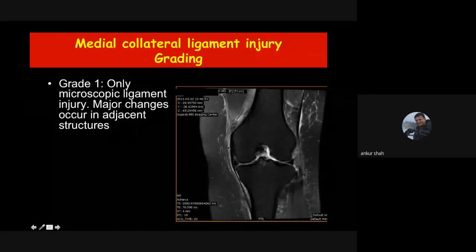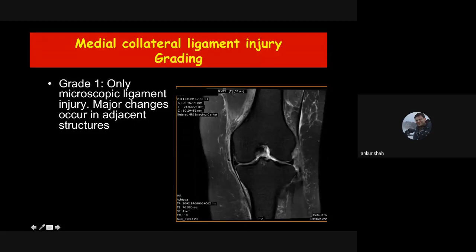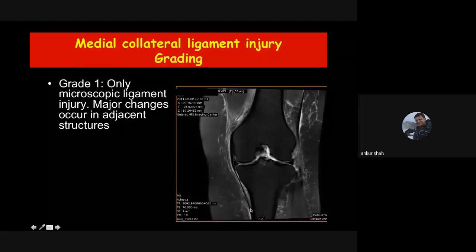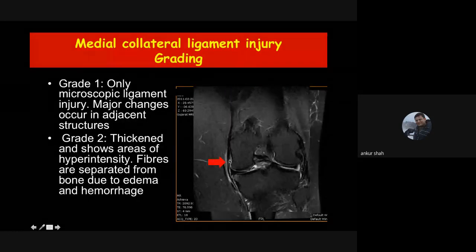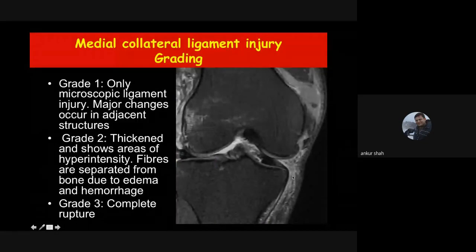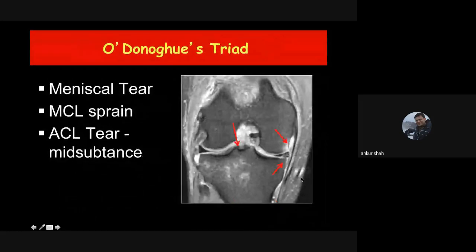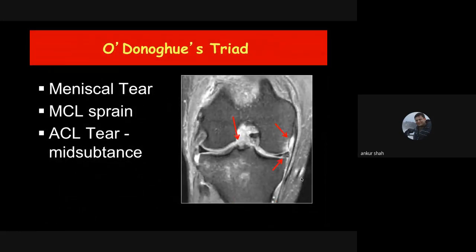Grade one MCL injury is when edema is seen only in the crural layer — outside the MCL itself. Grade two is when there is hyperintensity within the substance of the ligament. Grade three is complete disruption — the ligament is not seen at all. There is a term known as the O'Donoghue triad — the deadly triad of three injuries: meniscal tear, MCL injury, and anterior cruciate ligament tear. When all three are present together it is known as the O'Donoghue triad.